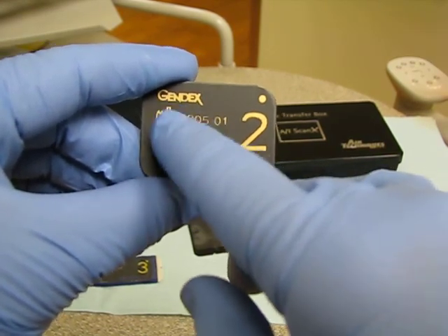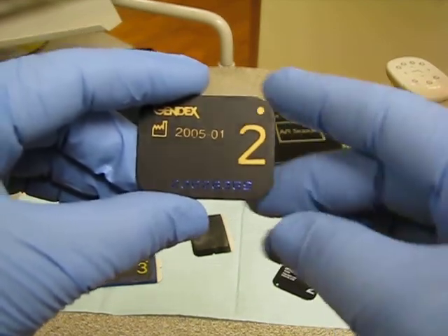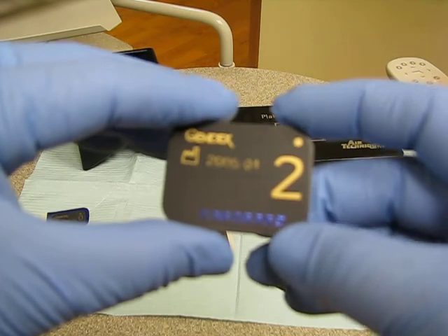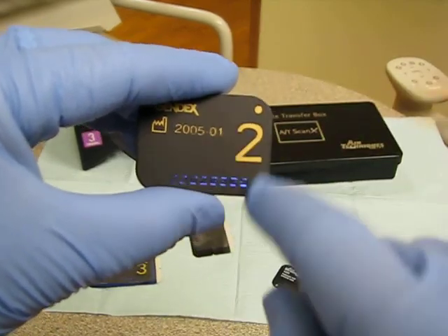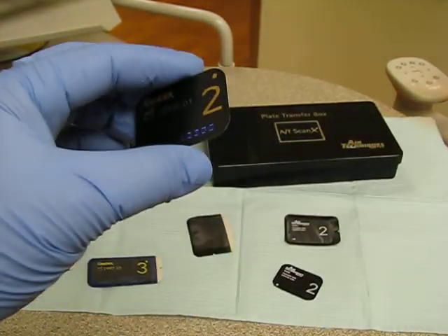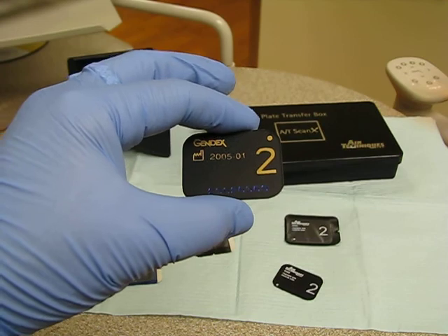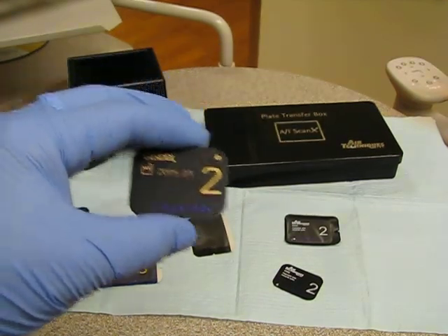Gendex is the brand. This little gold dot indicates 'dot in the slot,' and there's a little indicator on the back too. This indicates the year it was made, and that's the serial number to the sensor. Normally you can get anywhere between 800 to 1,000 exposures on a sensor before you have to buy a new one — the quality starts to degrade.